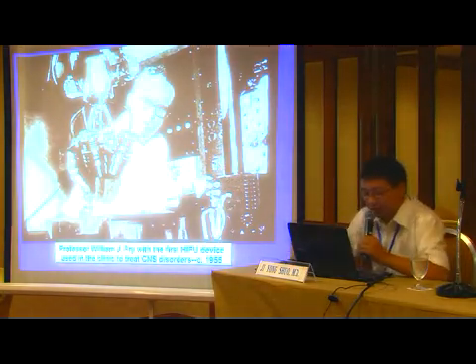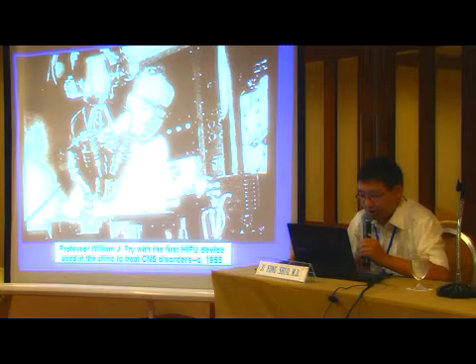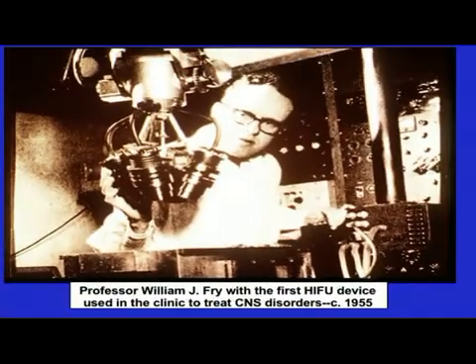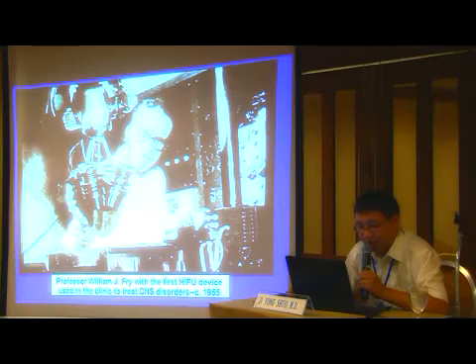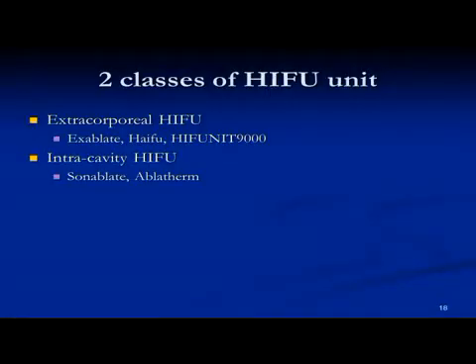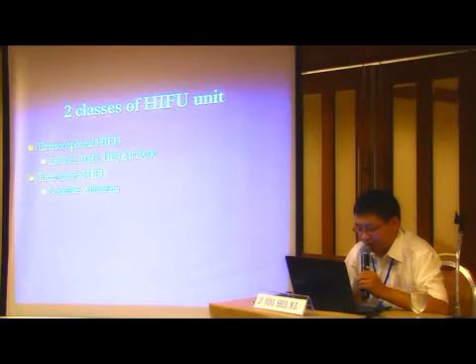A Fry used HIFU to treat CNS diseases in 1955. It was the earliest clinical record of HIFU, but it was experimental, and the equipment was not commercialized. At present, HIFU has two categories. One is the completely extracorporeal HIFU, and the other is intracavity HIFU, mainly through the rectum and vagina. Of course, the application range of the latter category is narrower.